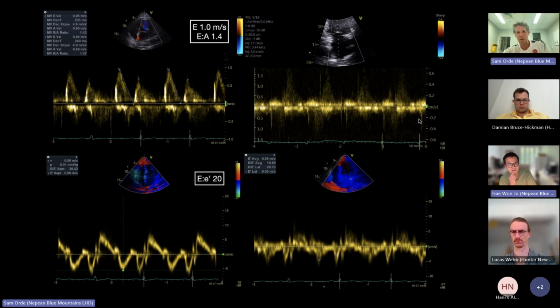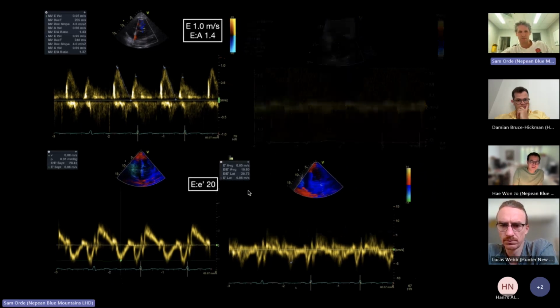What about this here? What am I measuring here? So it's a pulse wave at pulmonary vein. You're looking at pulmonary vein flow. I think there is systolic flow reversal. Nice. I think it's a bit of a blunting. It's definitely smaller. Blunting. Okay. Yeah. All right. Nice one.